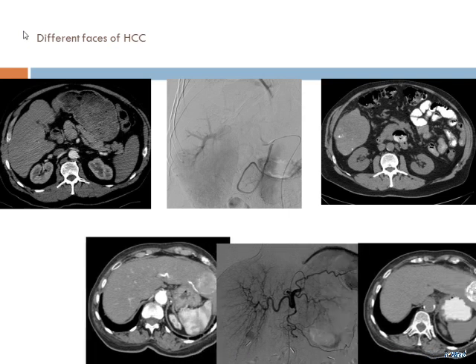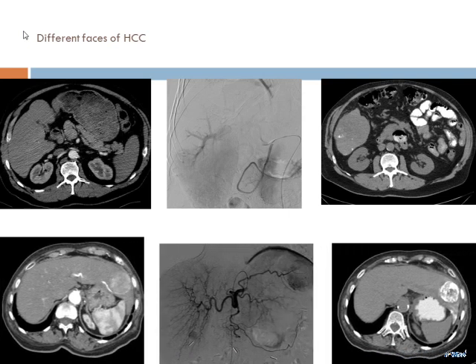The second patient is a dream patient for me, where you see a pre-procedure CT scan, you see the exact segment 2 vessel supplying the tumor, which has a very nice and localized blush. What does this mean? This means that I can go in selectively to this vessel and inject the mixture only to the tumor, because I don't want to damage the already damaged liver.